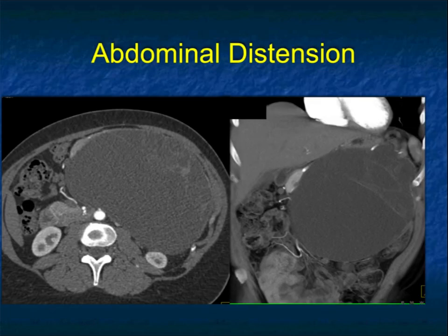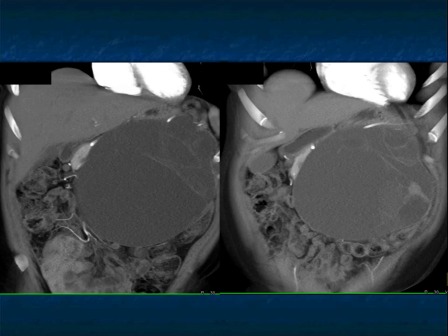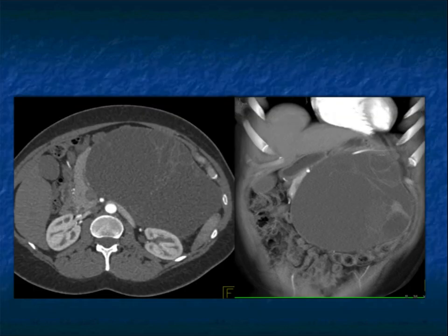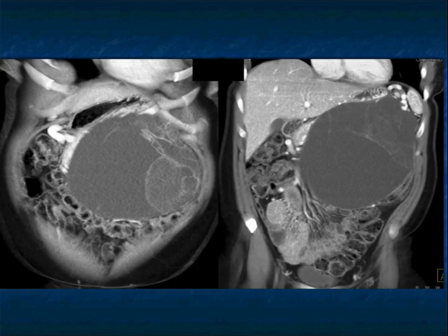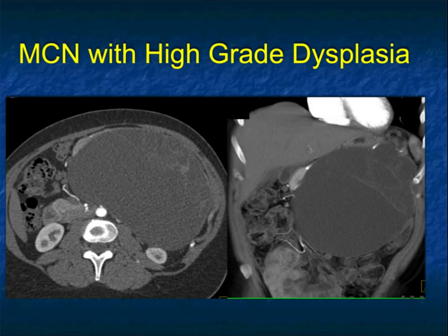Here's another set of images from the venous phase. Another patient with abdominal distension — not a surprise when you have larger tumors, the likelihood of presenting with symptoms is higher. Large septations, big cystic lesion. You could think: could this be a splenic cyst, a retroperitoneal cyst, a mesenteric cyst? But mesenteric cysts are well-defined, you usually see the entire pancreatic gland, there's displacement, and typically no septations. So this was a mucinous cystic neoplasm — a really nice example. Some solid components push you to worrying about high-grade dysplasia, which indeed it was.